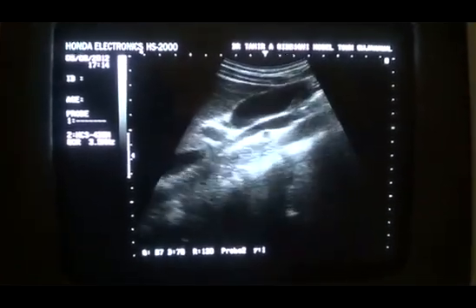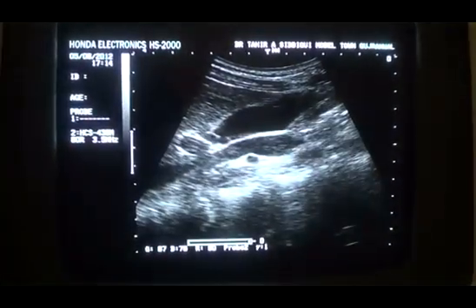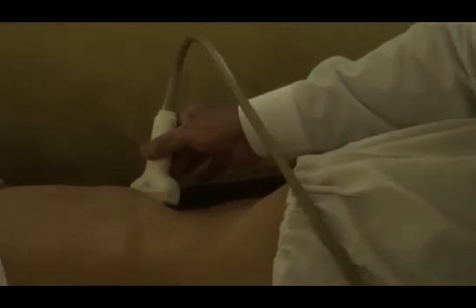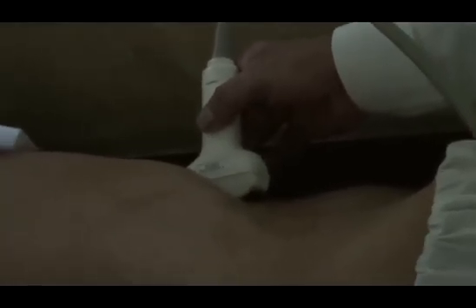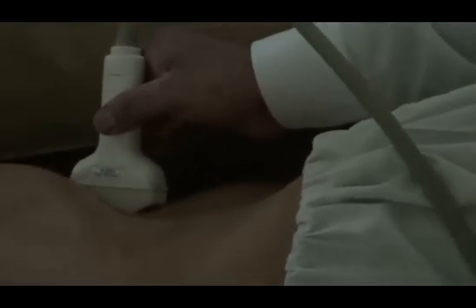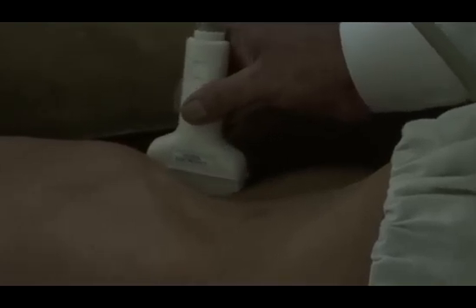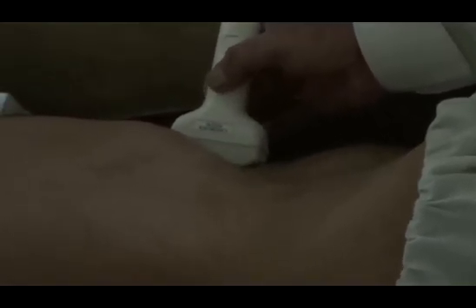Always see the fundus of the gallbladder. It is very easy — you just place the probe in the subcostal region at the mid portion, angle it downwards below the costal margin, and angle it downwards till you get the full view. Move the probe upwards if you feel you are getting the fundus at that region, or if not, ask the patient to take a deep breath and hold it to get your desired view.